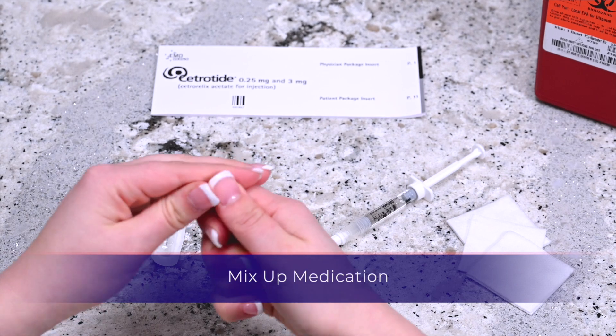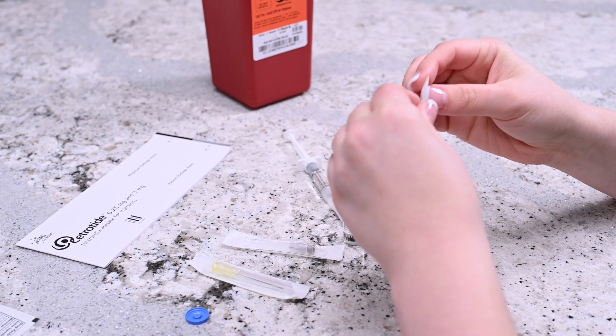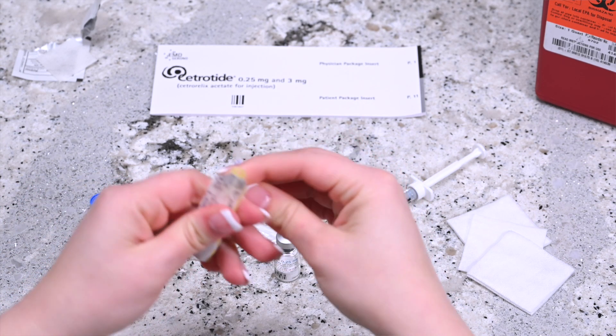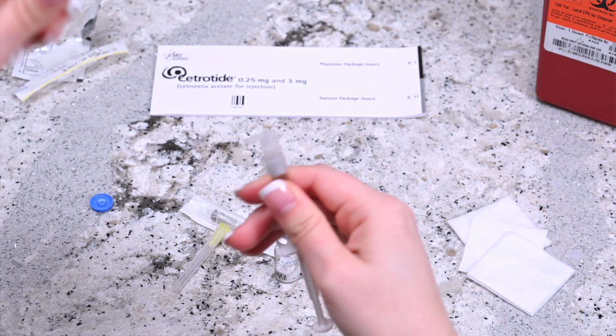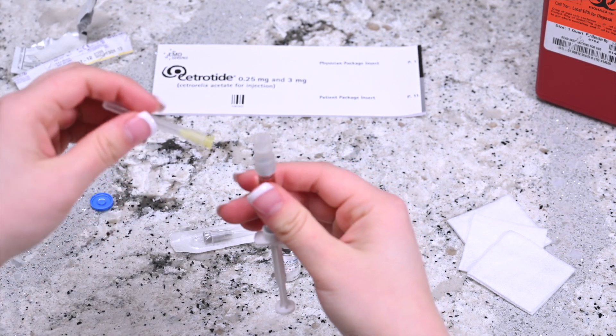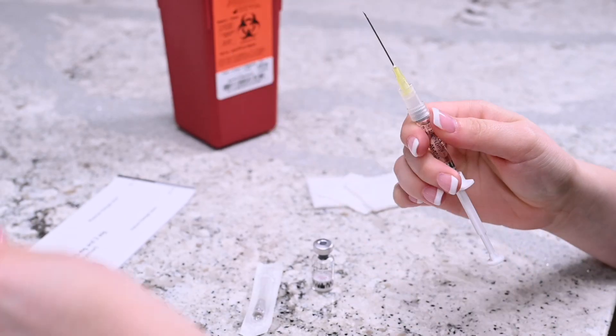Remove the cap from the vial of Citratide and disinfect by wiping the top with an alcohol prep wipe. Remove the 20 gauge one and a half inch needle for mixing from packaging. Remove the cap from the pre-filled syringe and twist the needle onto the syringe. Remove the cap from the needle.